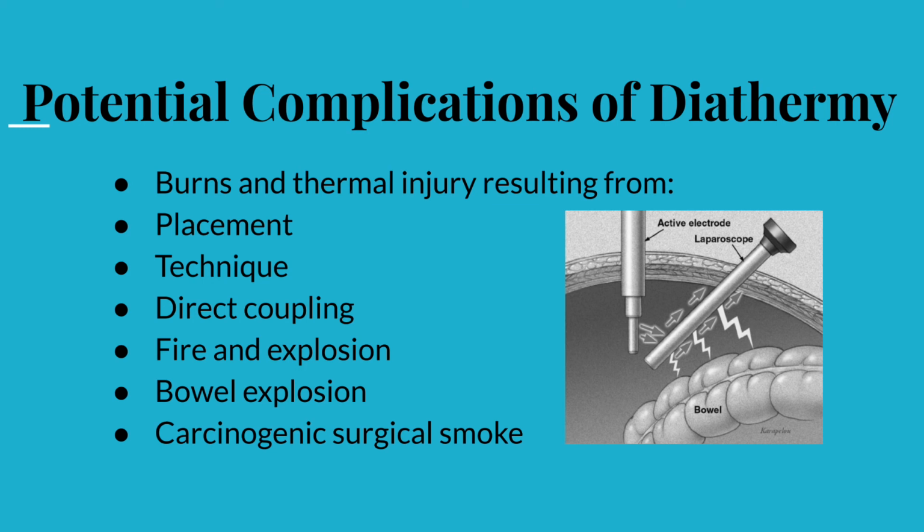Then there is also a risk of fire and explosion when there is aerosolized alcohol such as diethyl ether and cyclopropane that can make contact with the electrode to produce fire. Lastly, the smoke generated from the diathermy can potentially be carcinogenic as well.